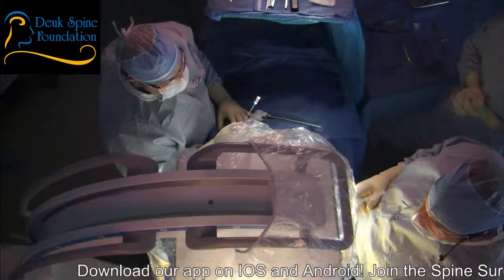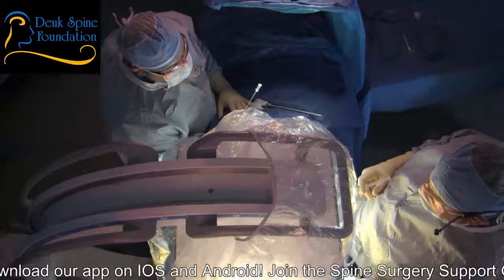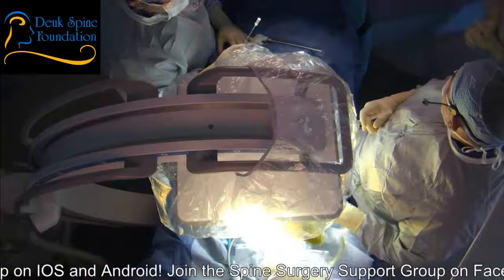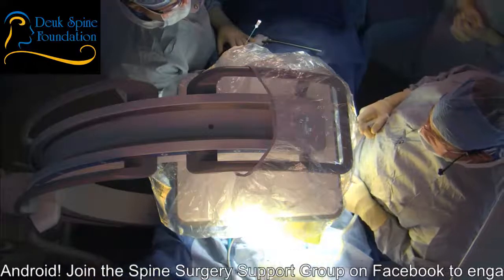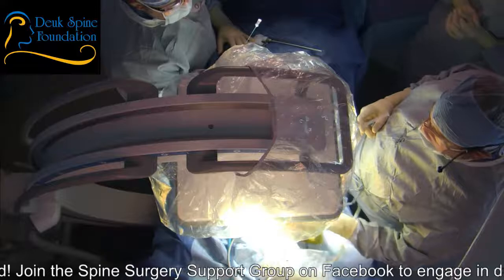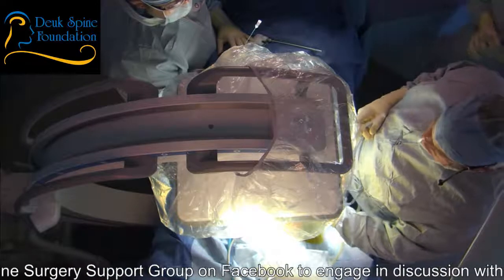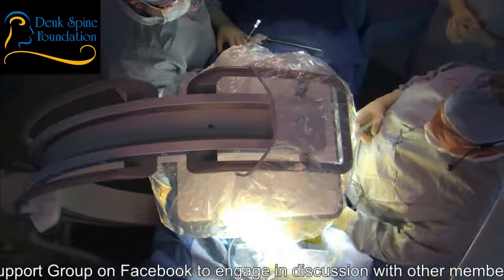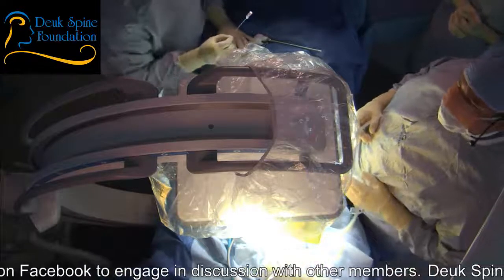All right, Dr. Deuk here. Are you awake? We're going to get started, okay? L3-4, L4-5, left side. We're all in agreement. All right, I'm going to give you some numbing medicine, okay? You're going to feel a little bit of burning in the back here, but that's normal. That's just the medicine going in, so don't be upset. If at any time you feel a lot of pain, say ouch, and I'll give you some medicine, but don't try to get up off the table.